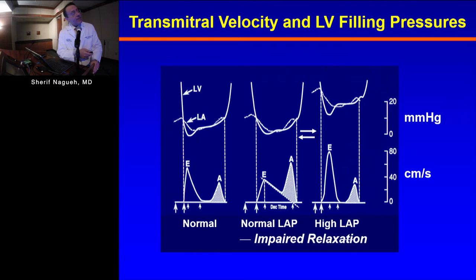And here we have even higher E velocity and lower A velocity, a ratio frequently more than one, and in restrictive filling defined by more than two. Very short acceleration deceleration times, high acceleration deceleration rate, and a short isovolumic relaxation time.